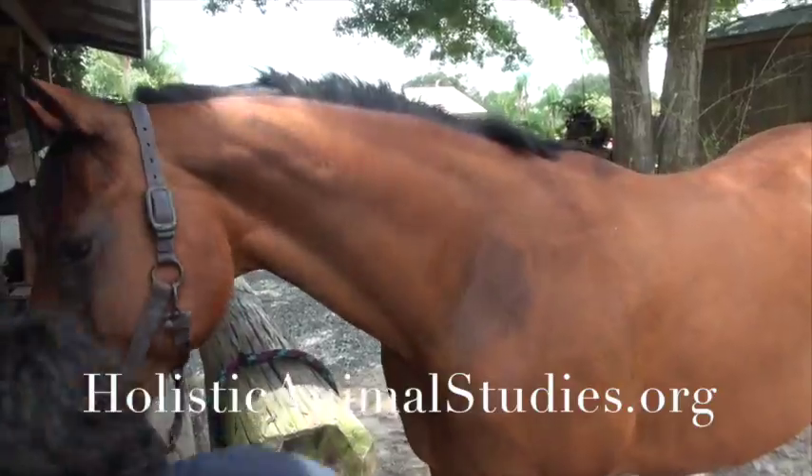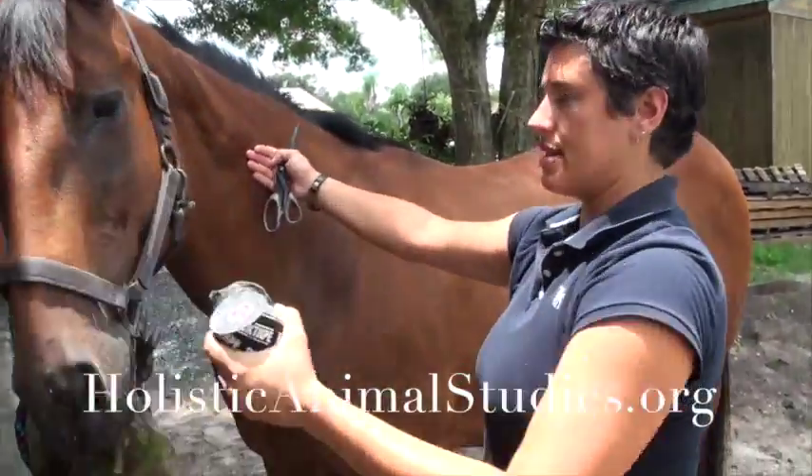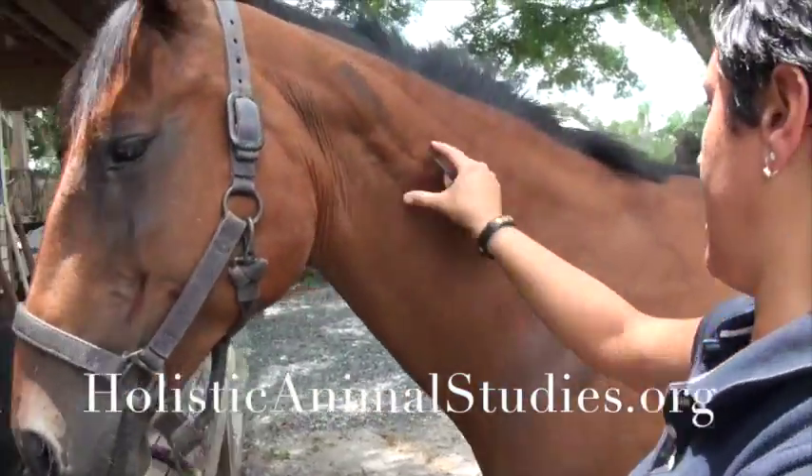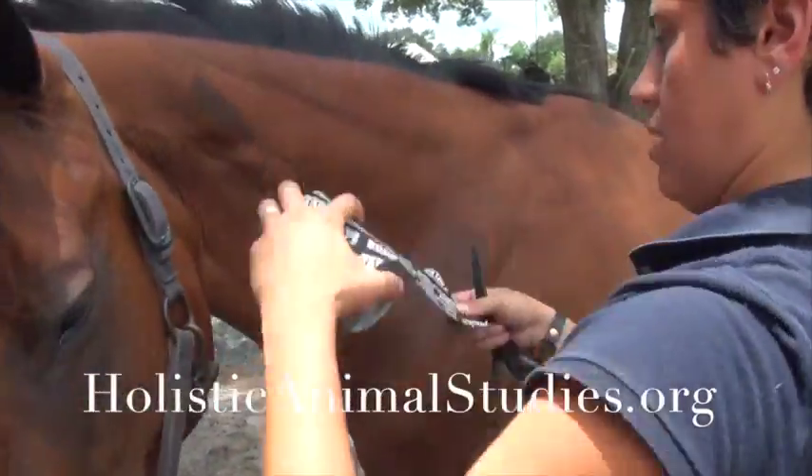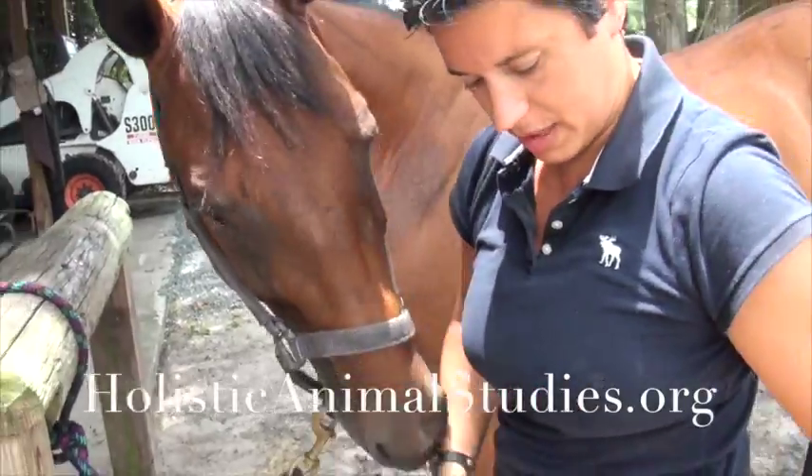I'm going to do a pain taping on Shea's neck. Let's say she's got a little bit of pain in this area. I'm going to show you what that would look like. I'm going to cut off a piece of Rock Tape that fits into the area where the pain is located.